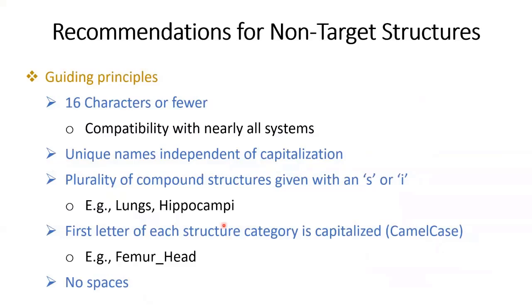So the guiding principle: 16 characters or fewer. You should not exceed 16 characters. So this is your maximum or cutoff value. Compatibility with nearly all systems. And this is compatible with every system, more or less. Unique names independent of capitalization. So you can use capital L or small L. It should give the same meaning in the system. It doesn't give you something else.